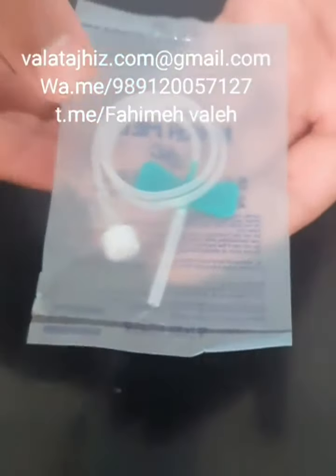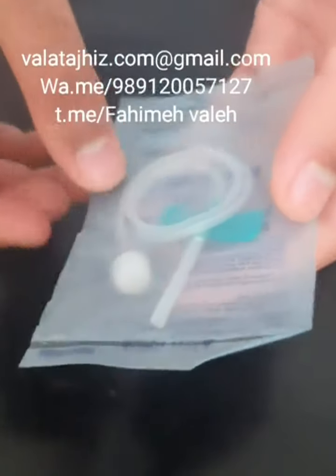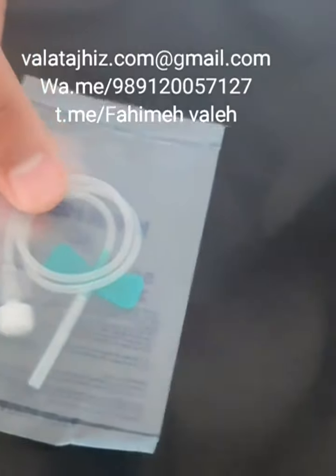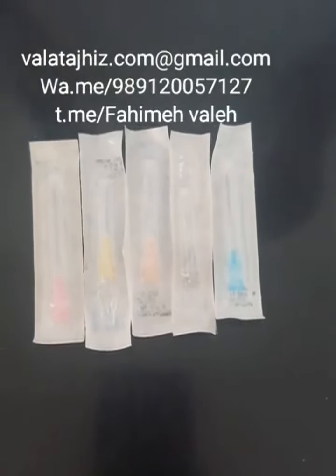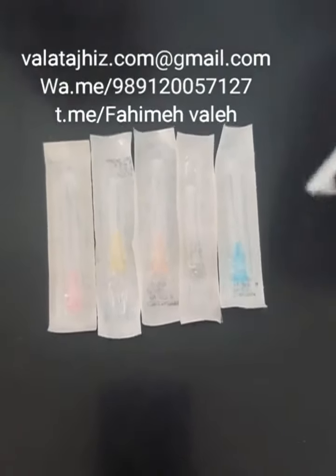This is a scalp vein set. These are sold in different colors — like this one is green. You can buy it in yellow or blue. And these are hypodermic needles, also sold in different sizes and colors like yellow or blue.